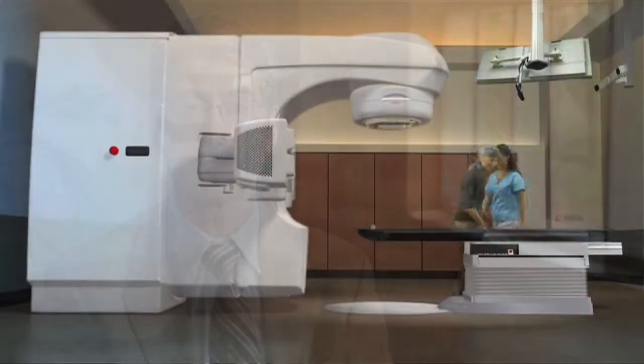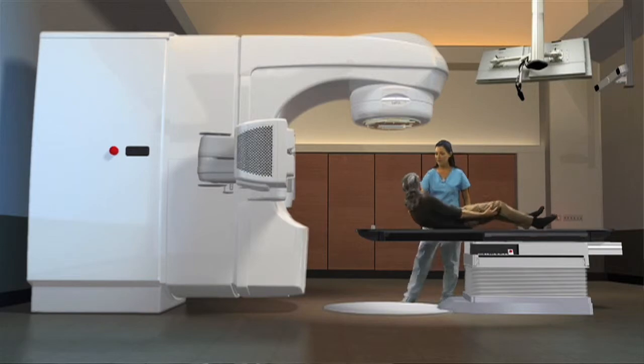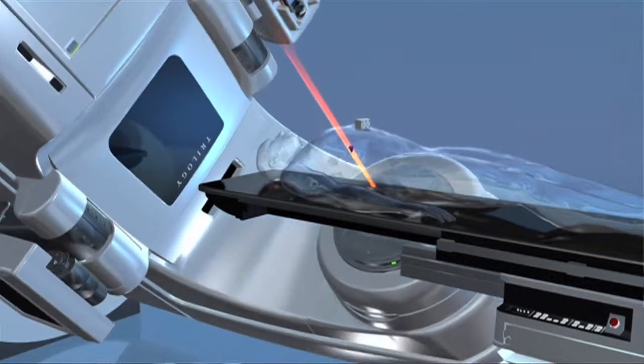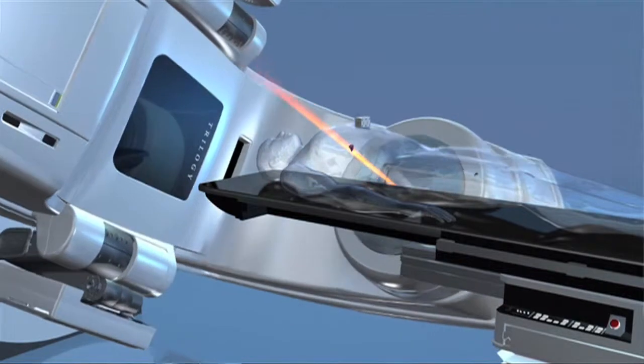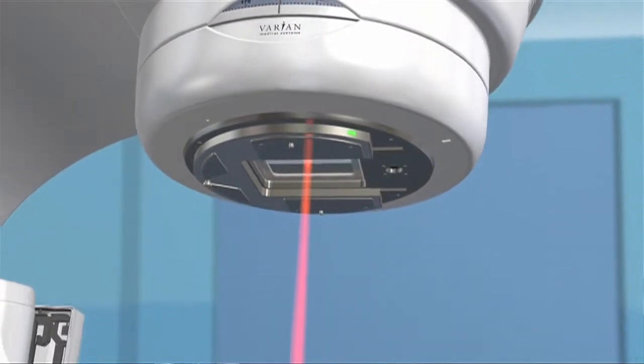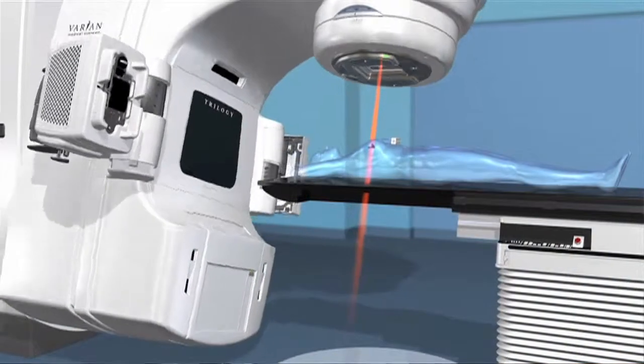Once the patient has had the plan chosen, then they come in every day for treatment. They lie down on the treatment table. A linear accelerator is a machine that rotates around the patient. The patient lays still on the table while the gantry rotates around and delivers radiation from different angles. It traditionally is done over a 5 to 6 week period, 5 days a week. The treatment could take anywhere from 3 to 5 minutes.